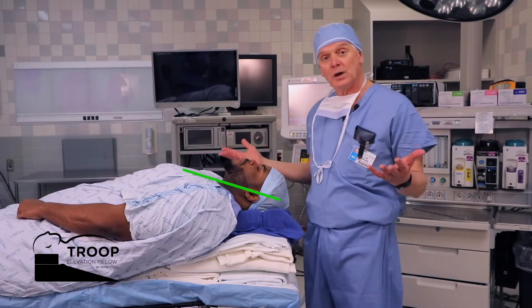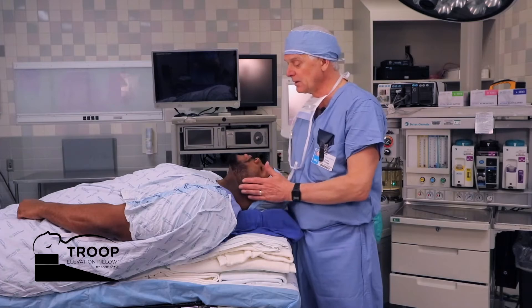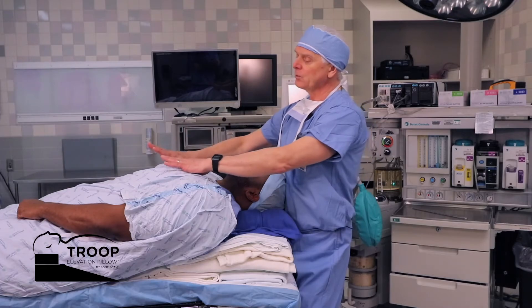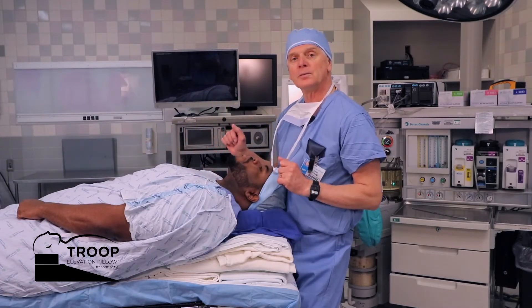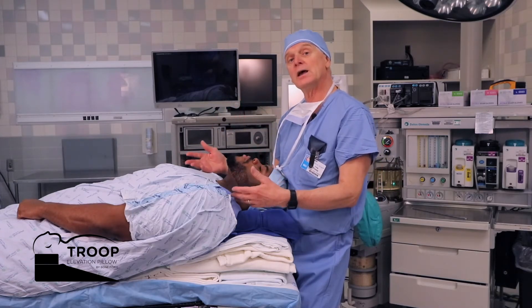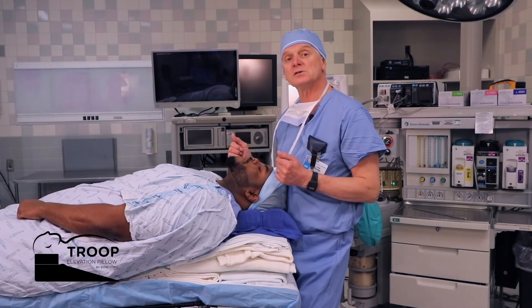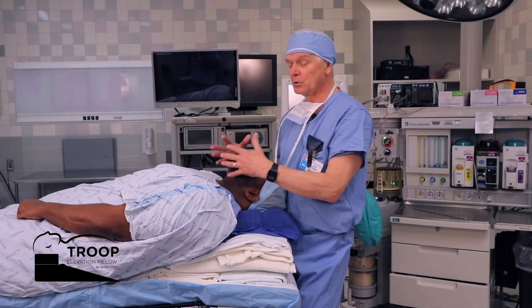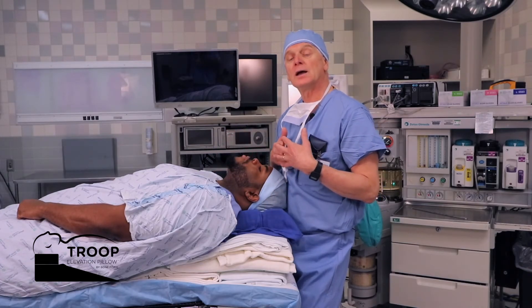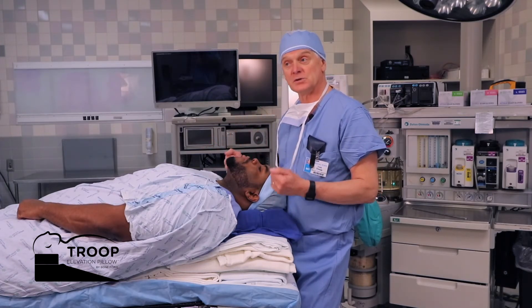The airway axes in that position are starting to line up. With slight extension of Quentin's head and neck, we see the three airway axes lining up and the weight of the abdomen is falling away from the patient's diaphragm. It's easier for the patient to breathe, and it's much easier for us, the anesthesia providers, to both mask ventilate and improve the first pass successful intubation rate when the patient is properly positioned.